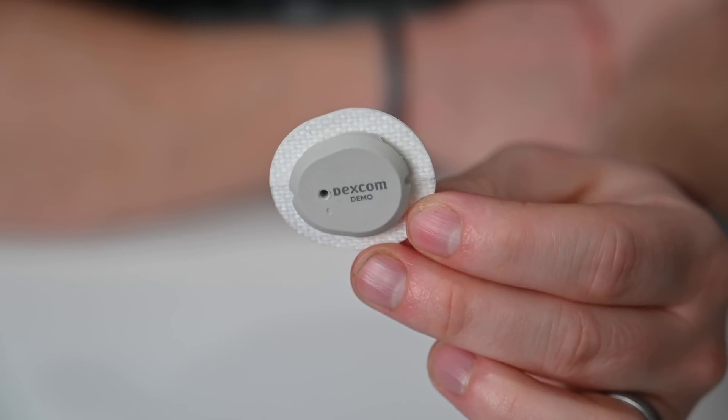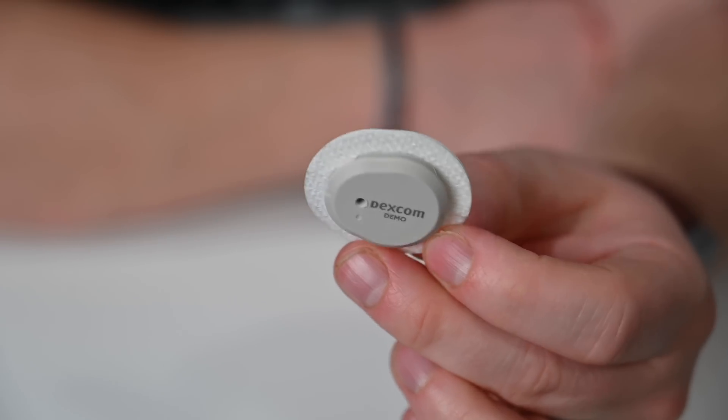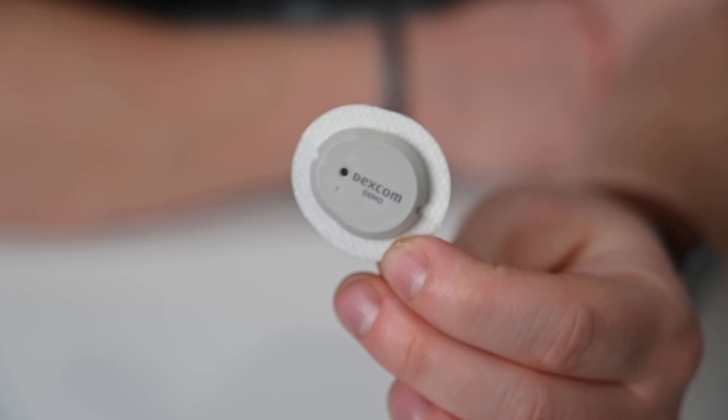The Dexcom G7 has an all-new design that's actually 60% smaller than the Dexcom G6. I'll give you a hands-on look at both side by side in just a moment. Additionally, it has a faster warm-up time — now only 30 minutes rather than the full two hours that the Dexcom G6 required.